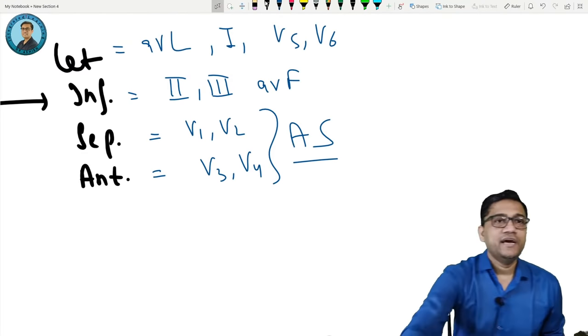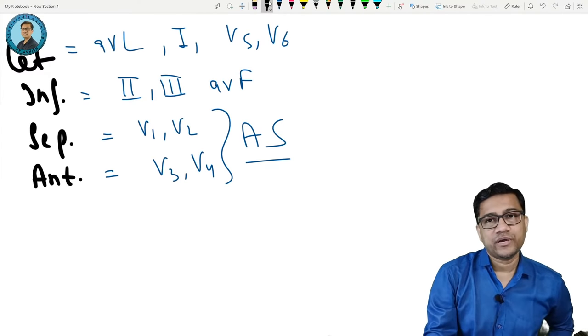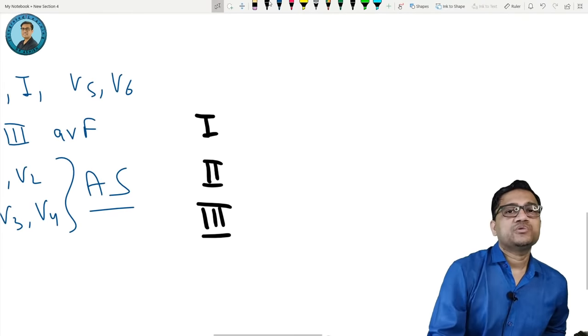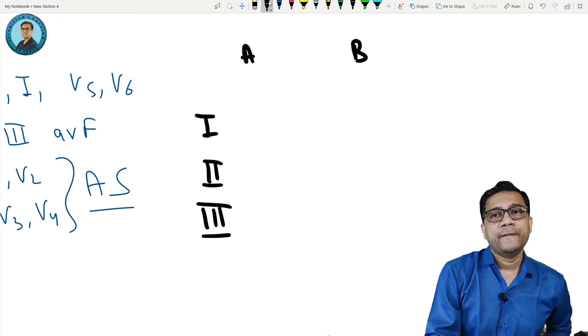Okay, then how do you know the axis? How do you know the axis? Okay, I'll make you tell me. 1, 2, 3. I'm giving you some ECGs to solve. So this is patient A, B, C. Okay, look at this.